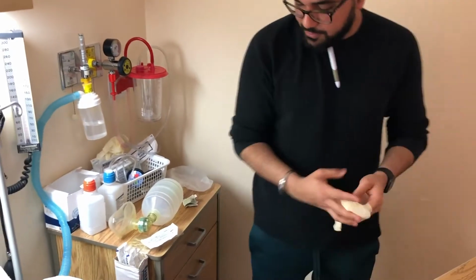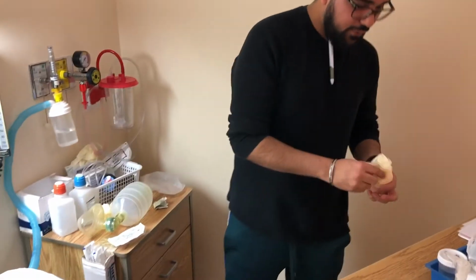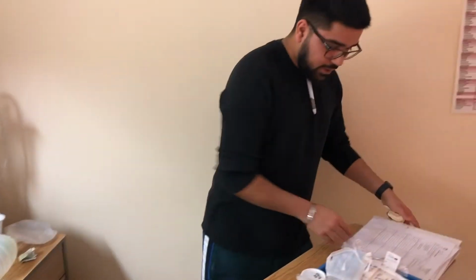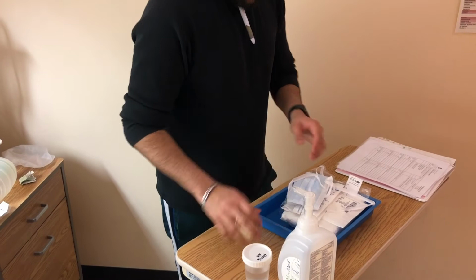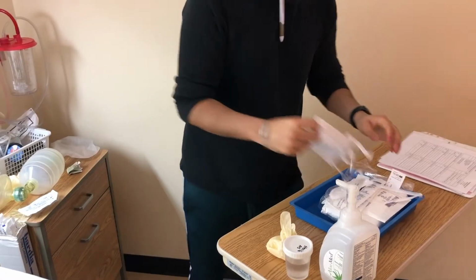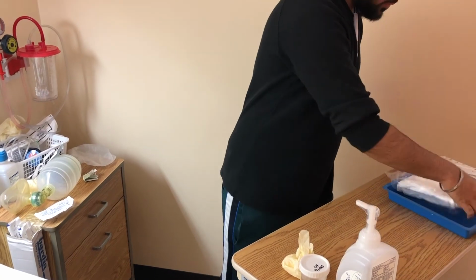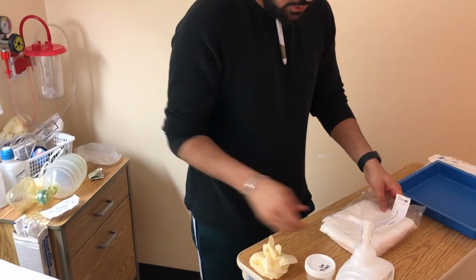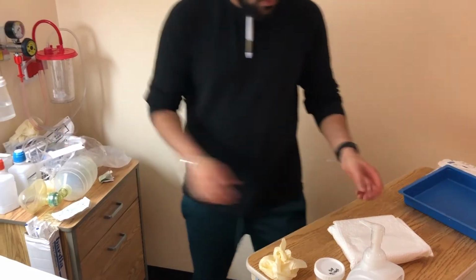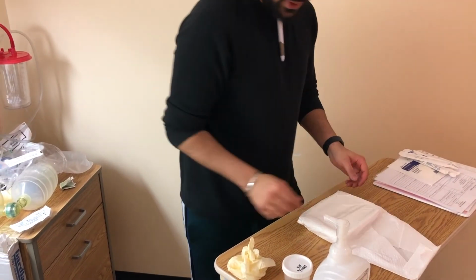And then I would remove these gloves and put on new gloves for our dressing change. So I'm just gonna get everything set here. Now I'm just assessing the site here. I can assess the site as well. So I'm gonna open this up.